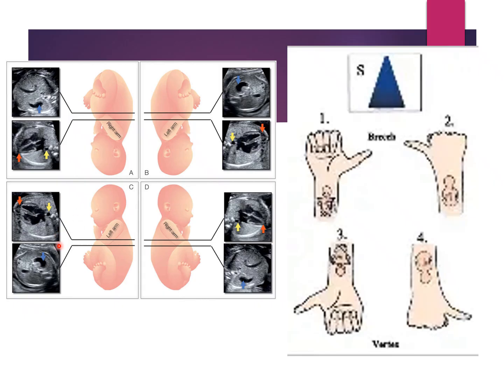In the next one, we're going to talk about stomach now. Okay, so we know the stomach stays on the left side. So we have spine and we have stomach. And when we are looking at our stomach, it is on the left here.